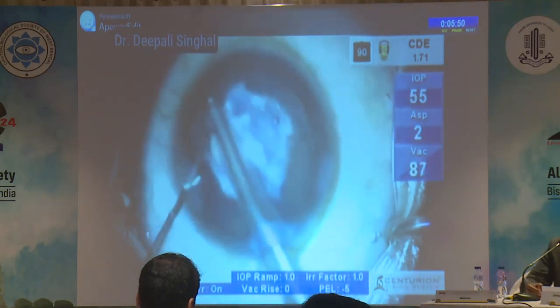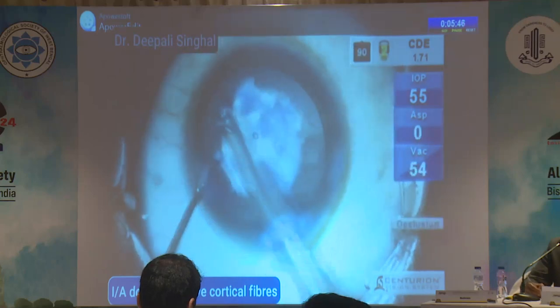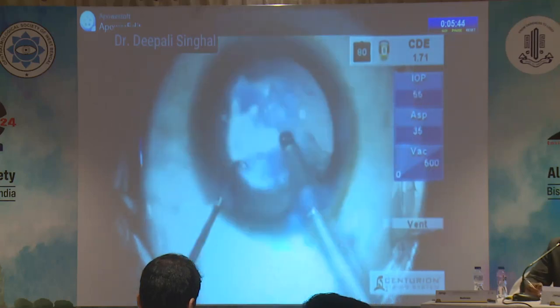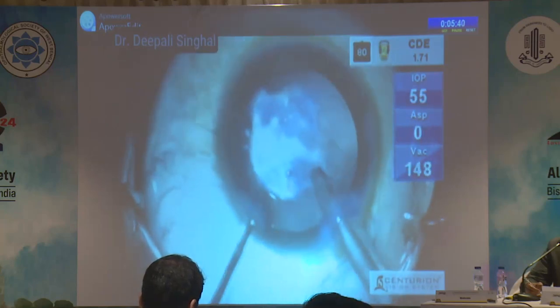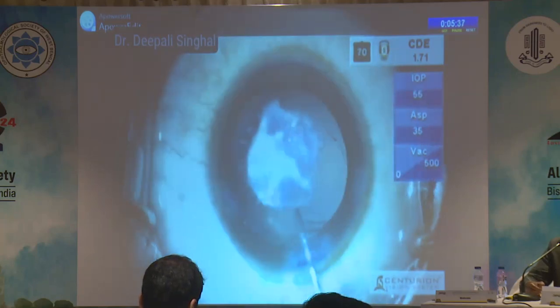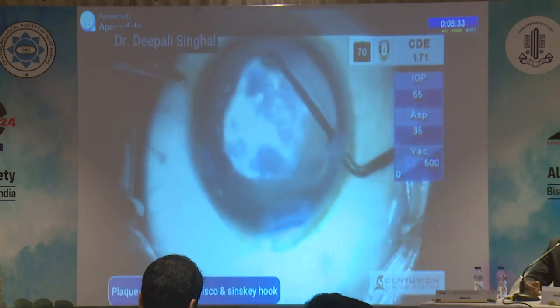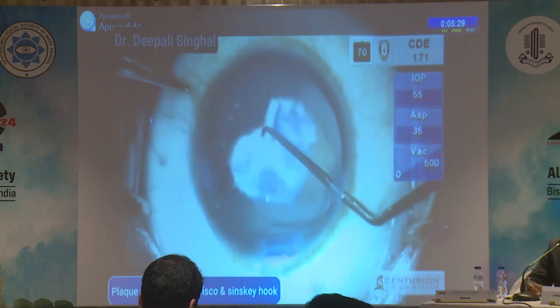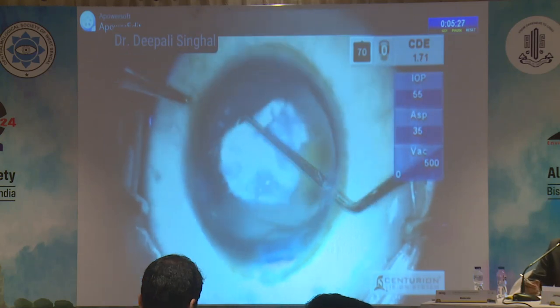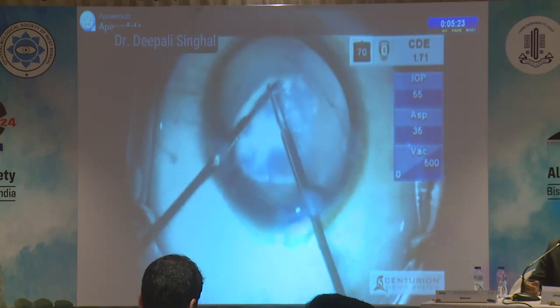Then glow was visible and dense plaque was seen attached to the PC. So first I removed the peripheral cortical fibers with IA probe. Then I injected visco alongside the plaque and tried to peel it with a dialer, but the PC was getting distorted and there was a risk of PC tear. So I used micro scissors to cut the plaque along with the PC en bloc as a mass all round.